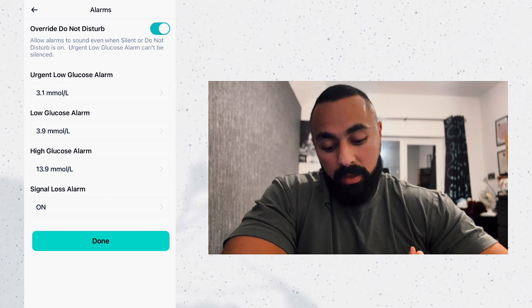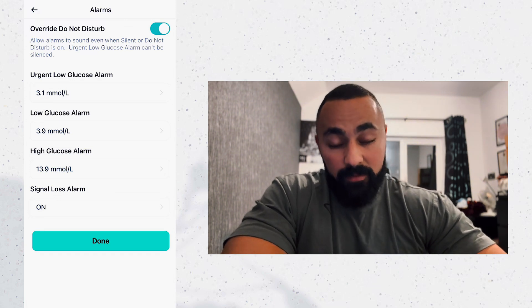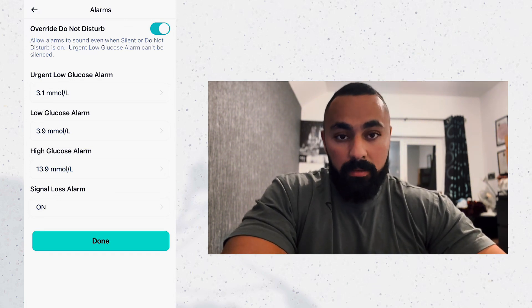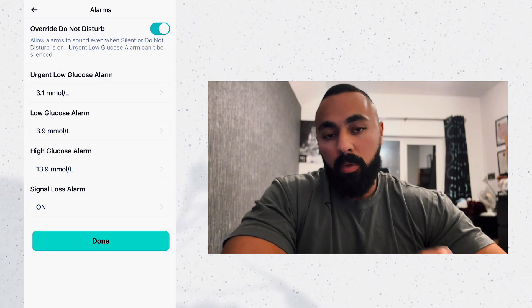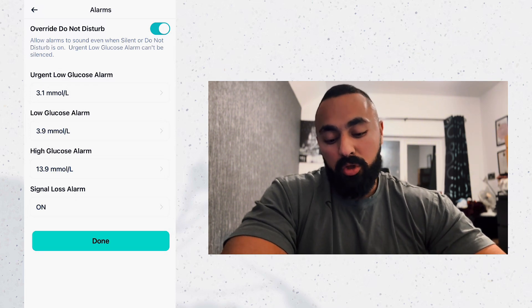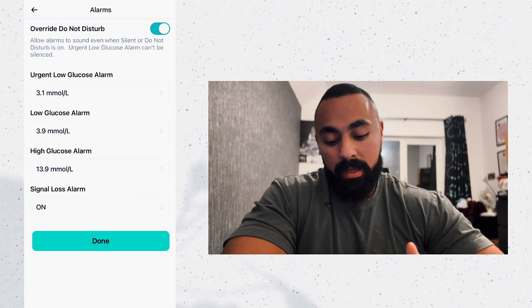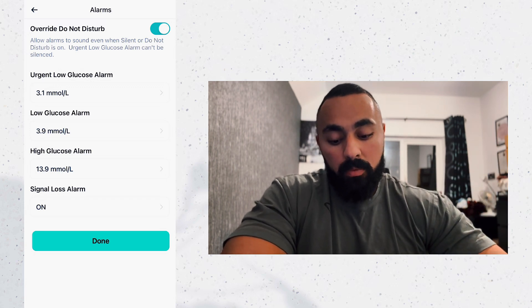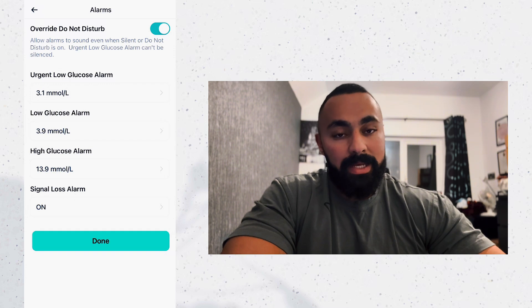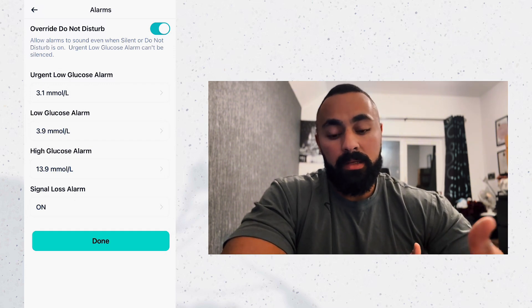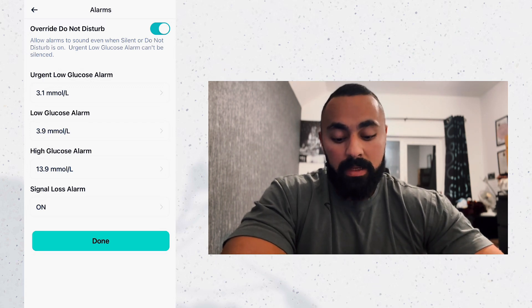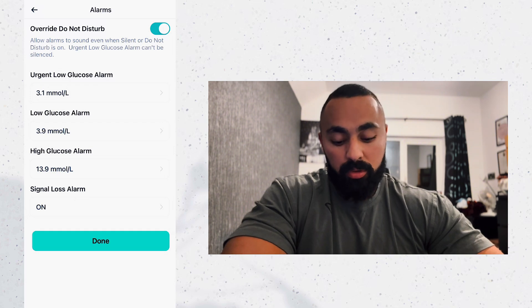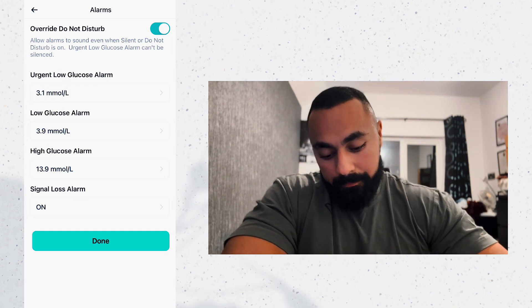Now let's look at alarm settings. You decide to set the alarm the way you want. My low glucose alarm is at 3.9 millimoles per liter, and my high glucose alarm is at 13.9 — though personally I'd treat anything above 9 or 10. I don't want to be alarmed every minute. Normally I have this at 10, but because of illness I set it a bit higher. Urgent low is at 3.1 millimoles per liter — this overrides everything: Do Not Disturb, your phone's silence mode. It's great especially if you have a child with diabetes.